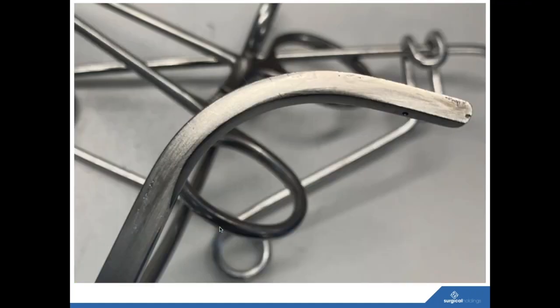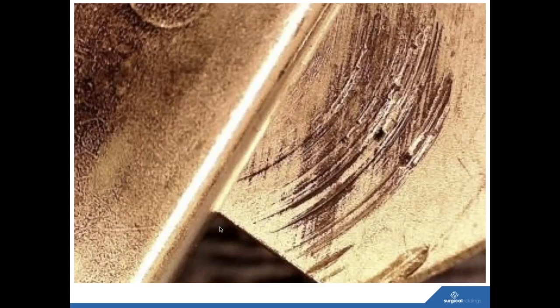Daniel, that's a really good point there. I'll bring up something that I share here in the United States. I often tell customers or hospitals that I'm working with that they do not even need to use the lubrication cycle that's in their washer disinfectors. Often the amount of lubricant being injected into the cycle, if you divide that by the number of instruments in the chamber, means they're getting really minute traces of lubricant, and a lot of hospitals rely on only that. They're not lubricating at the inspection and assembly station where they should be, because that's where the staff can really feel the tightness of the box lock or the joint of the instrument. They can see that kind of staining. But like you said, it's important that when they see this starting, they send these instruments out to get refurbished as soon as they can. Otherwise, it will definitely lead to pitting corrosion.